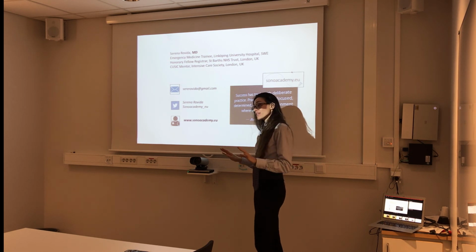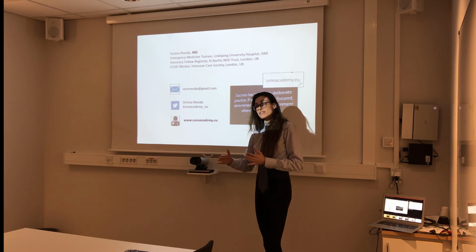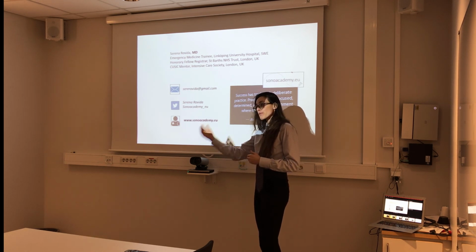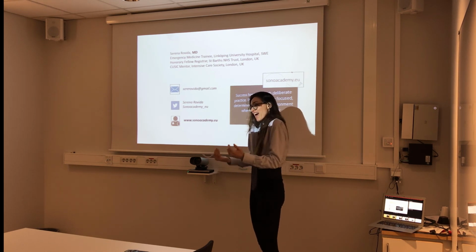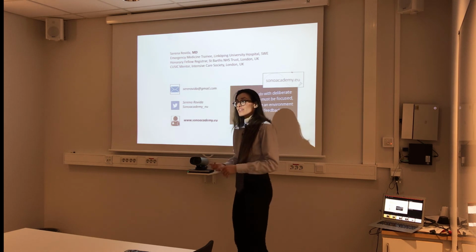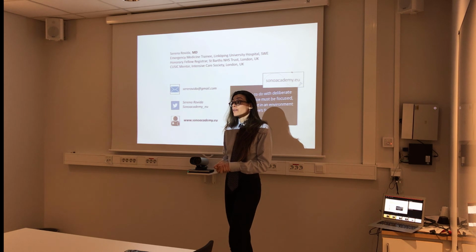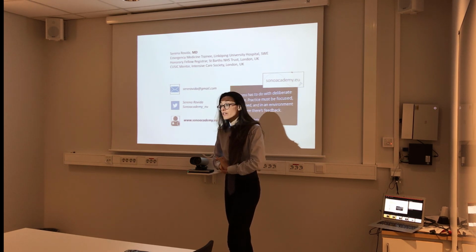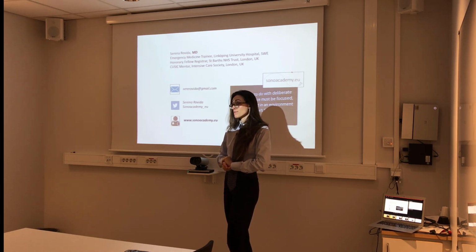Now, when you get an SBO on the CT scan, try to have a look at it, find a little bit of air and try to see the peristalsis, especially in unexplained abdominal pain in a patient that may have a risk factor like adhesions, previous endometriosis, or previous surgery, okay? Surgery accounts for 80% of bowel obstruction, a lot. But 20% is others, like spontaneous adhesions. Happy? Okay.